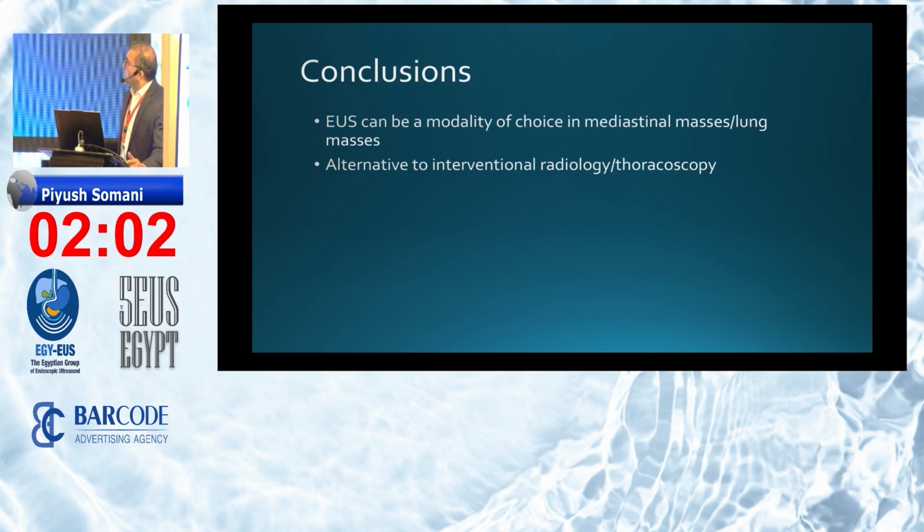So concluding, EUS can be a modality of choice in mediastinal and lung masses, and it can be an alternative to interventional radiologists or to the other modalities which include thoracoscopy or mediastinoscopy.